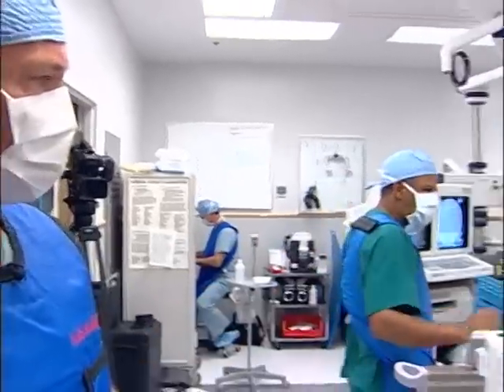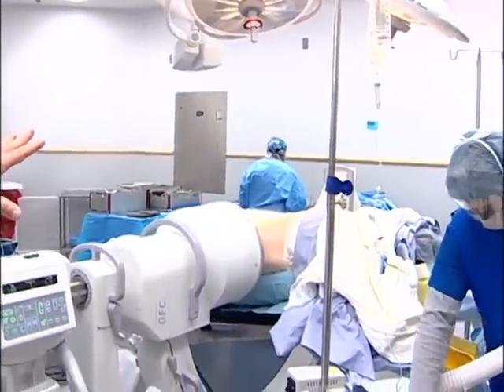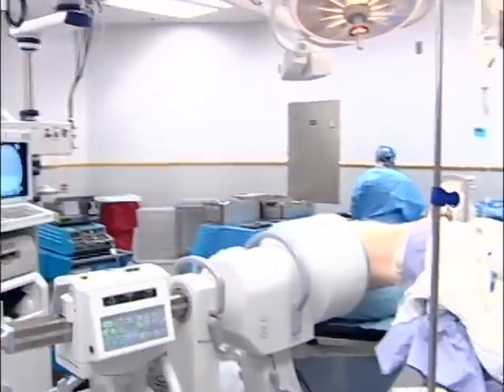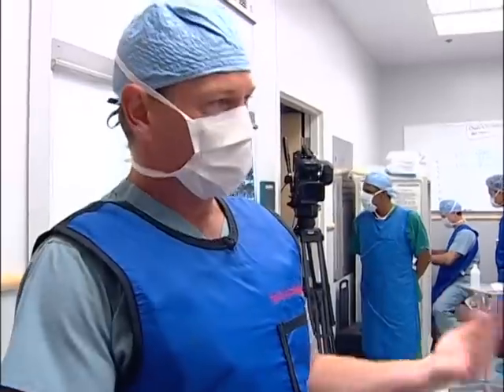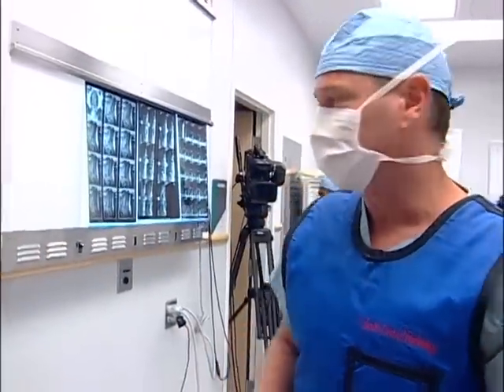On lumbar cases, we'll use biplanar fluoro. We'll do all our preoperative marking first, which will be done starting with lateral plane, going to AP plane. We'll mark the skin incision, figure out our target. At that point, we'll come out, we'll expose, and begin with the screw as a first step.